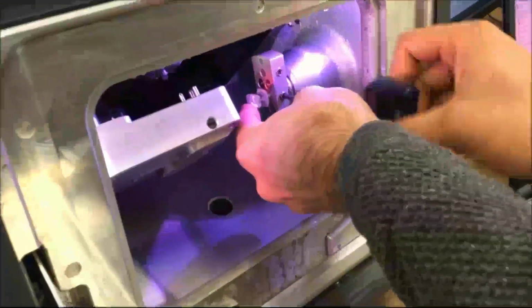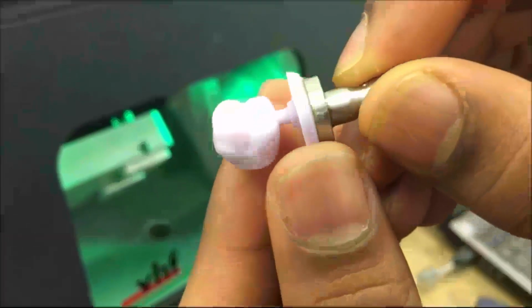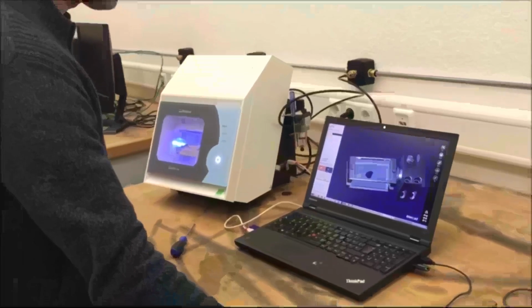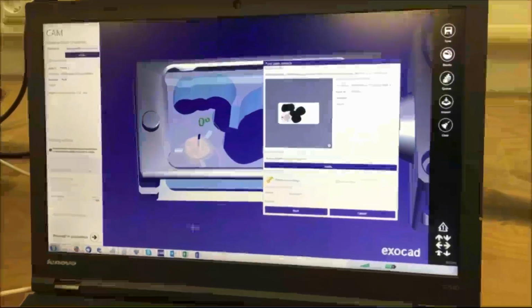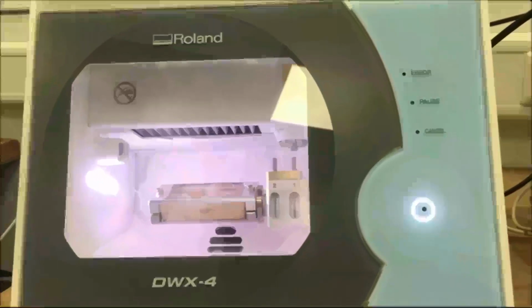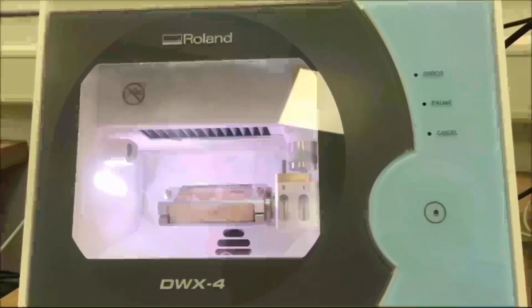This could be verification of machining templates for different indications and materials for different types of CNC machines, or it could be testing of different algorithms and features after the development within our simulation software.